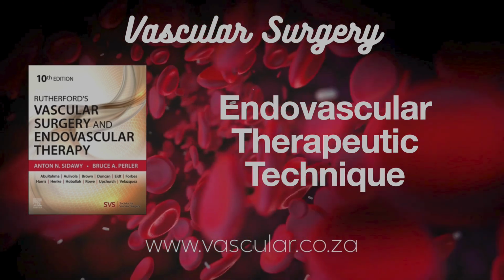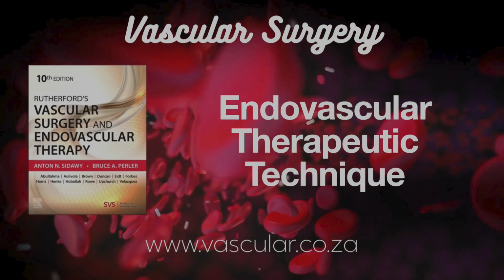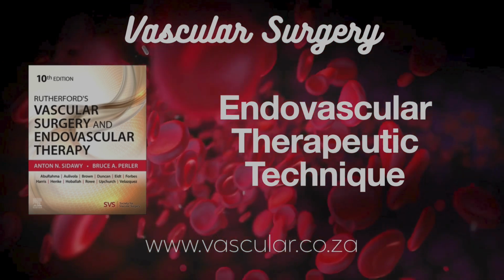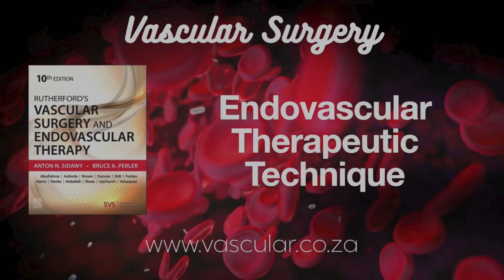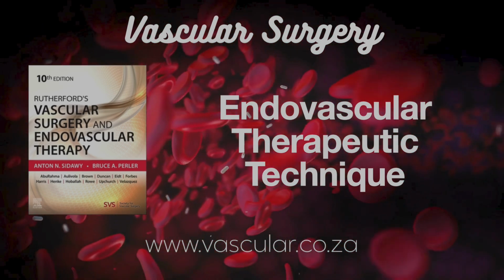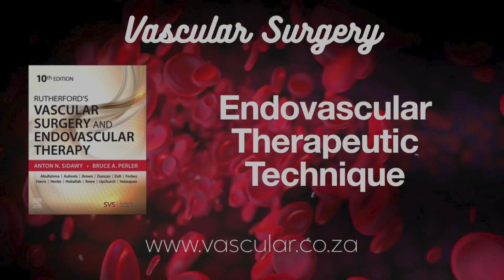What about longer term? Did the benefit last? Good question. Some studies now have data out to 3 years, and generally they show a sustained advantage for DCBs. Higher primary patency, fewer repeat procedures needed compared to PTA. That durability was encouraging. That all sounds very positive for DCBs, but I seem to recall some controversy, some safety concerns cropping up later. You're right, there was.